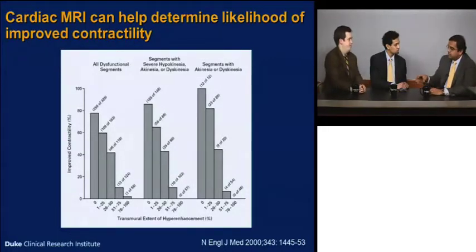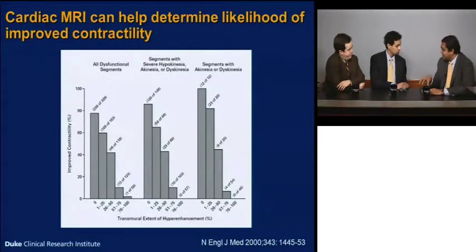I think it's good points. And you also, by the way, exclude things we haven't even talked about here today, which is non-ischemic cardiomyopathy. We saw occluded vessels, but it's certainly possible people have mixed pictures. Sometimes on MRI you see other infarcts or things you haven't thought about. So I'm not saying it's not feasible. And then, again, the risk to the patient has to be put into revascularization. A lot of times viability is used to make the operators and the patient feel comfortable that the risk is going to be worth the benefit that might be downstream.